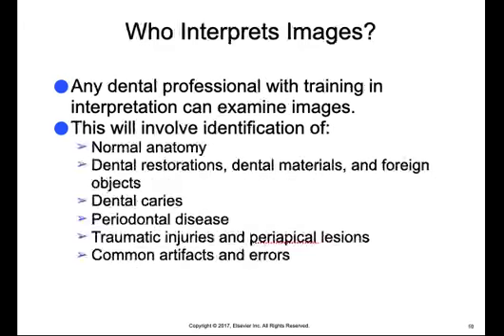So training is necessary to interpret dental images. Any dental professional with training in interpretation can examine images. Both the dentist and the dental hygienist are trained to interpret dental images. The dental assistant, however, may or may not be trained in the interpretation of dental images. And the amount and scope of training in dental images dictate whether the dental assistant can perform image interpretation.